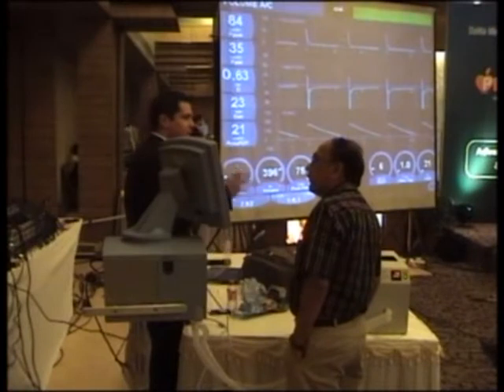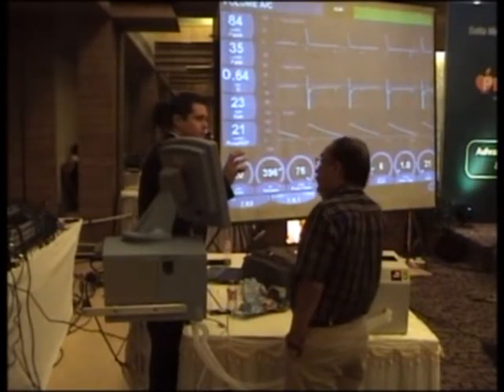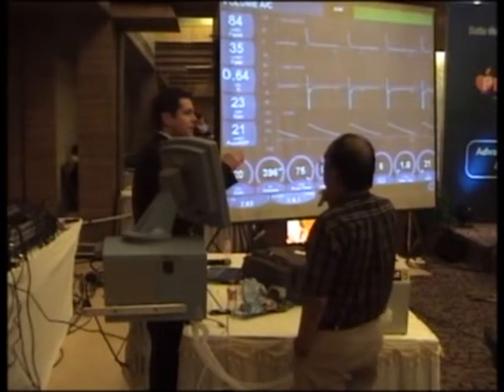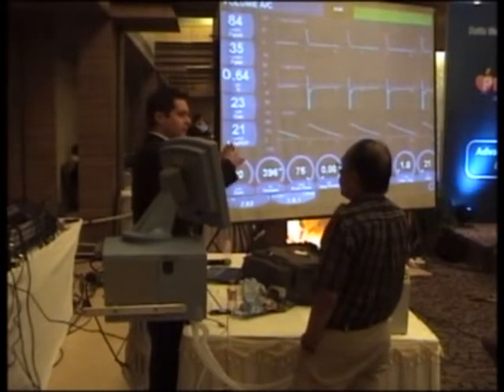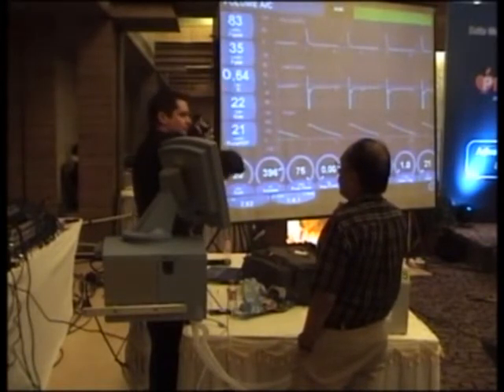And it looks like your carbon dioxide levels, how many of you use end-tidal CO2 here? You have a way to look at that? So what would your end-tidal CO2 waveform look like? Would it look like a square? Or would it look like, and then come down?